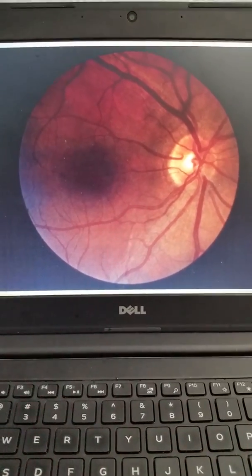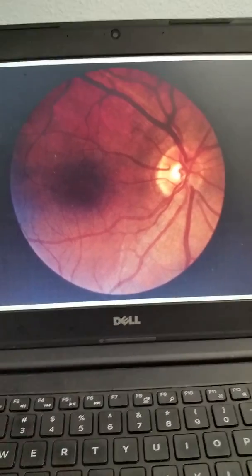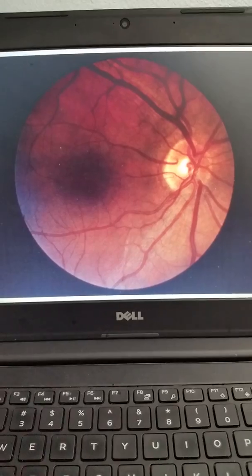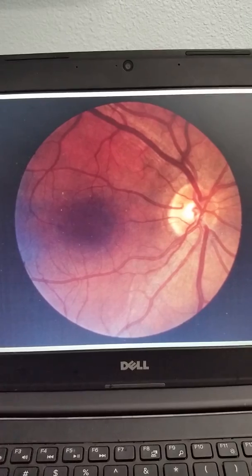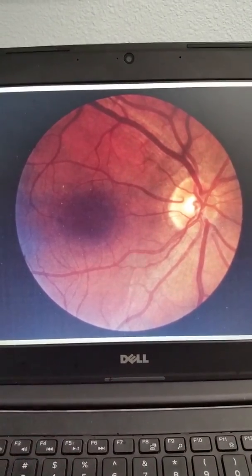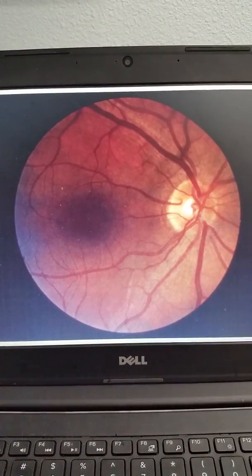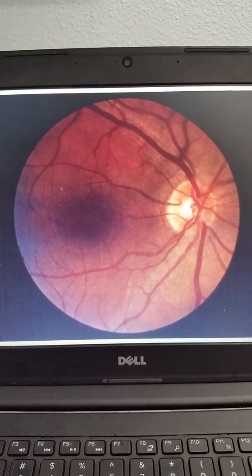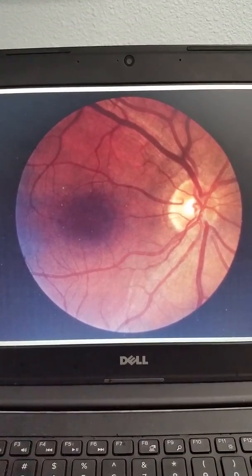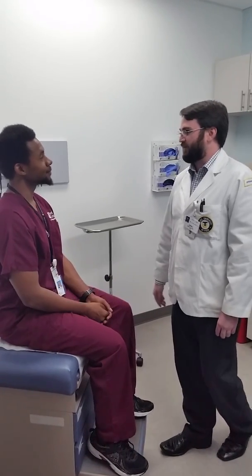We're going to go now to the live examination with our two performers. We'd like to thank Jeff and Deshawn — though as things happen, our models today are actually Jeremy and Deshawn. Here we go. Hello, I'm student Dr. Stevens and I'm going to be doing your eye exam today.